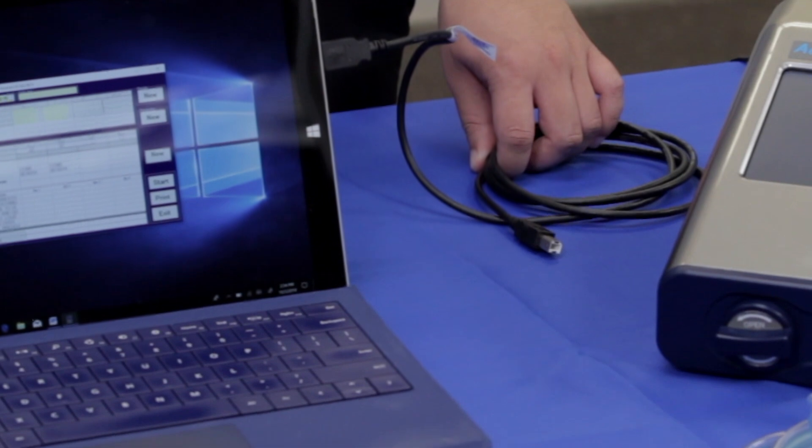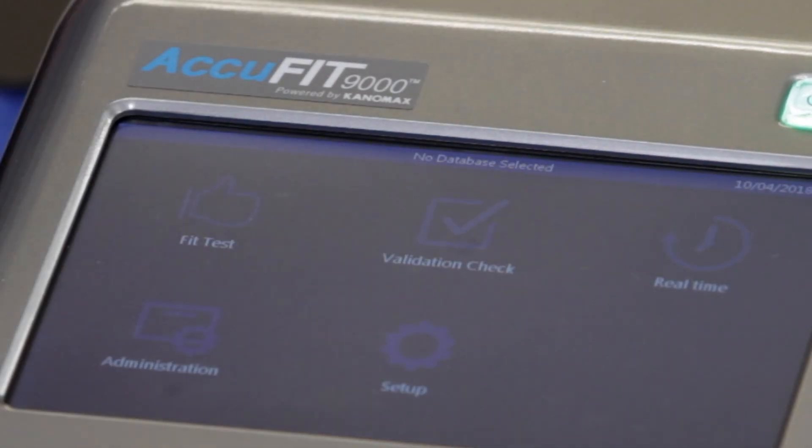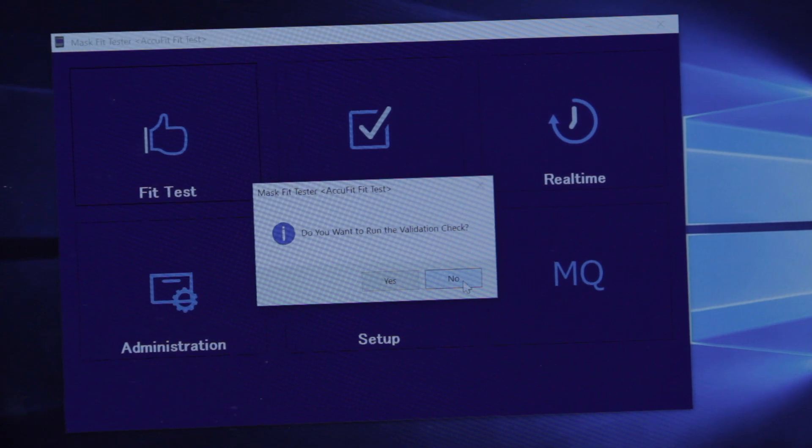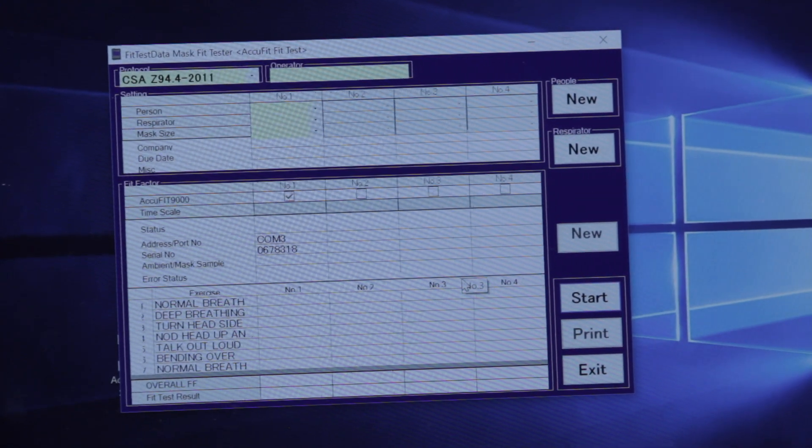PC mode offers additional features with the use of the included software to manage fit test records, protocols, due dates, respirators used, and people.